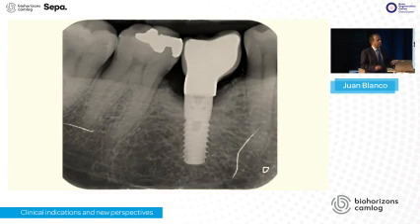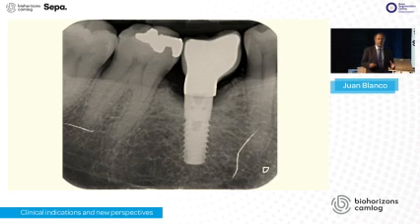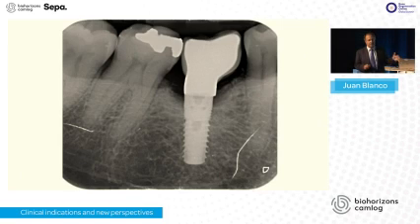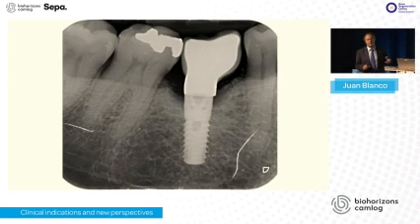And take a look to the X-ray. The X-ray now has a better look than was clearly before. So the objective of the treatment is completely achieved in terms of we were able to eliminate the peri-implantitis, the infection, but also improve the healing of the soft tissue that probably is going to offer us a better prognosis in the long term.